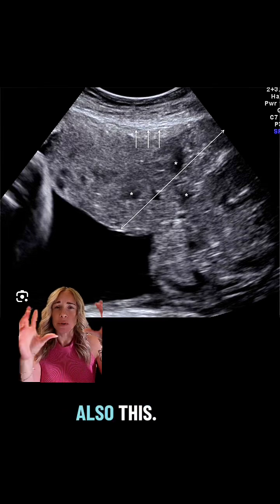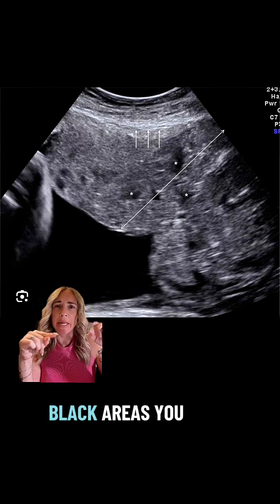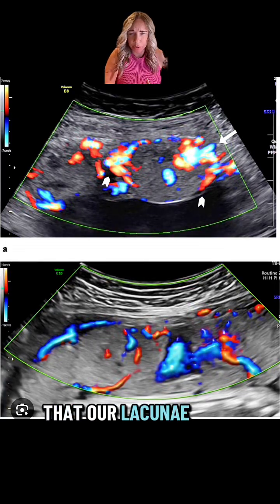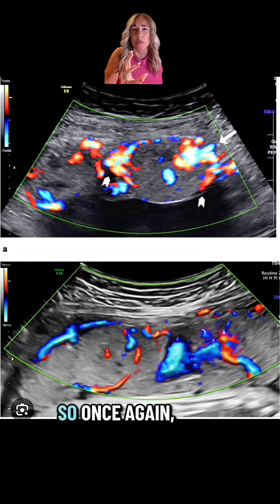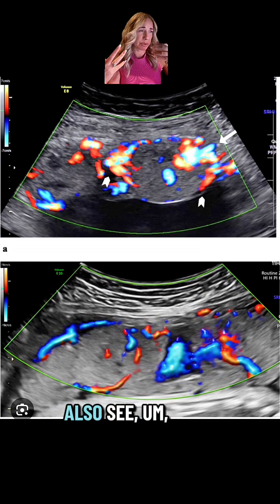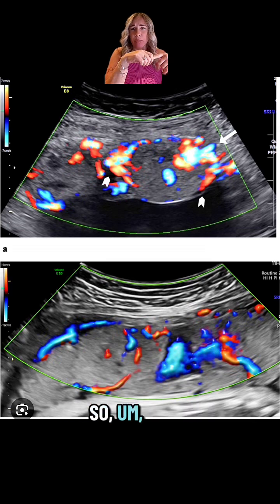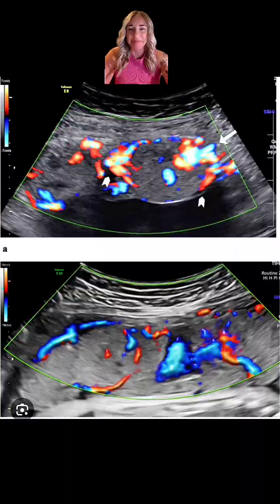And then also this placenta is very lobulated and it's filled with lacunae, which is the black areas you see in the middle. Here you notice that our lacunae have increased turbulent flow. So once again, that's a telltale sign. You'll see lots of flow within those lacunae spaces, and then you'll also see some subplacental vascularity. So once again, that's an area to look at while you're assessing the placenta.